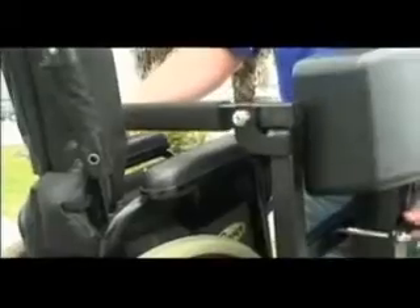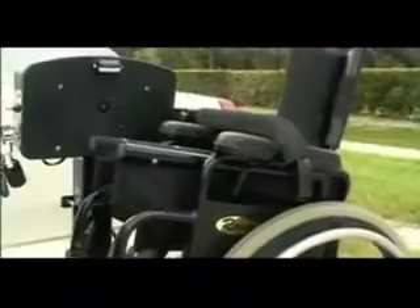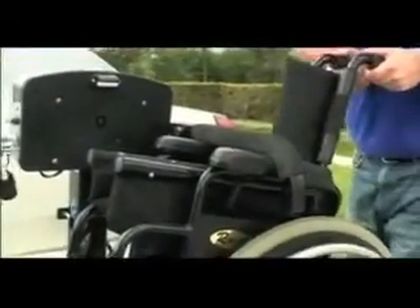Lower the chair approximately two inches. Loosen and lower the hold down arm assembly until the hold down arm presses firmly against the wheelchair armrest. Retighten all bolts securely. Raise the lift again until you hear the ratcheting sound. Ensure that the hold down arm is firmly pressed against the armrest in this position and that the wheelchair is held securely to the lift.